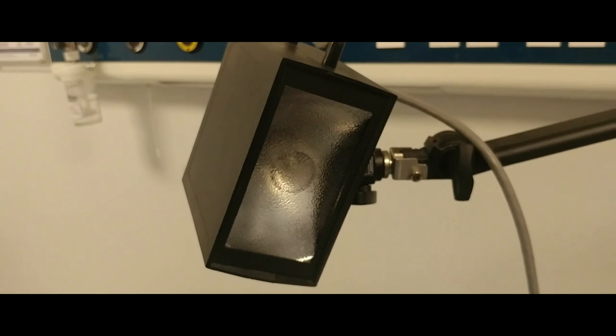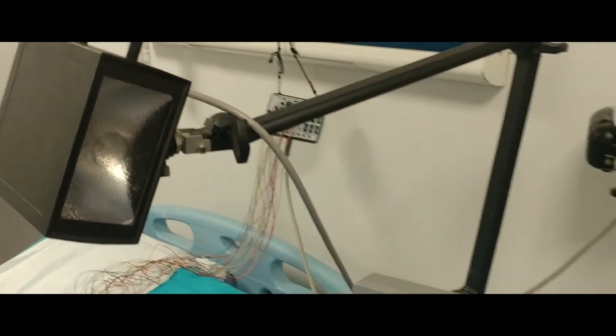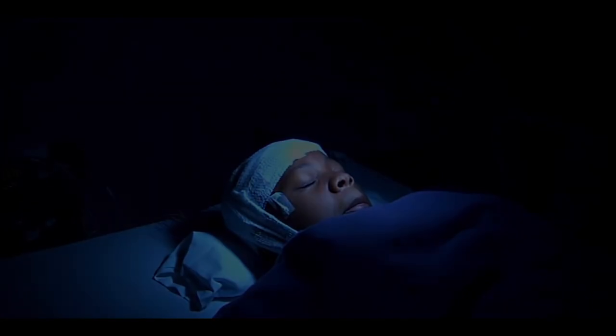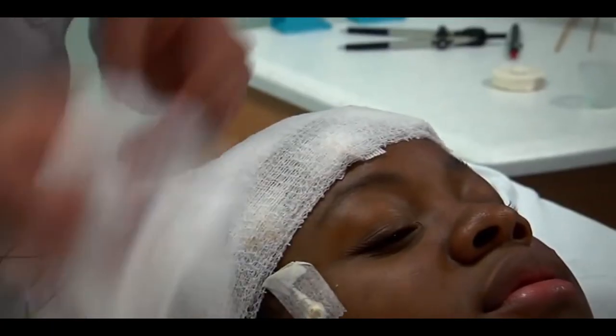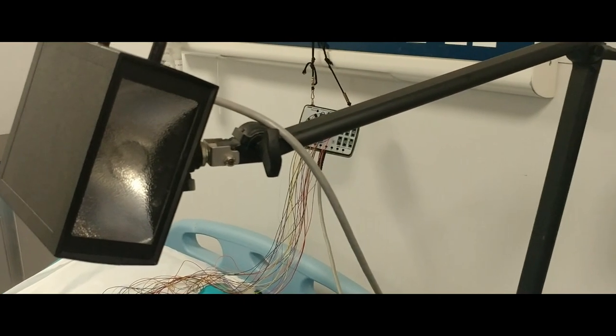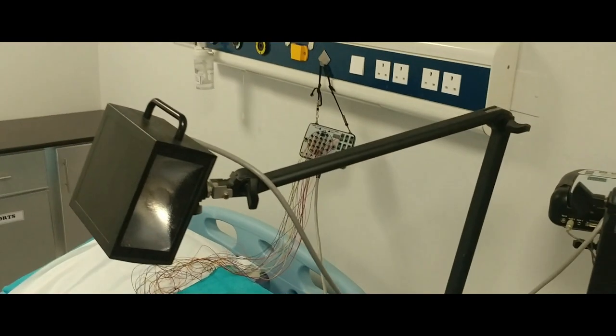Fourth is intermittent photic stimulation. The standard technique for intermittent photic stimulation (IPS) is a presentation of a series of photic flashes delivered by a strobe light at a measured distance of 20 to 30 cm from the patient's face. During eye closure, a series of stimulus trains of increasing frequency is presented for 4 to 10 seconds, with a pause of 4 seconds between each train, up to a frequency of 30 Hz.